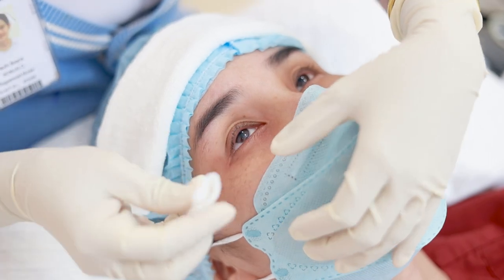With this technique, the patient can see the quality of the lipid that we release from the meibomian gland.